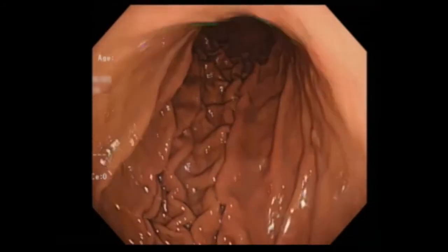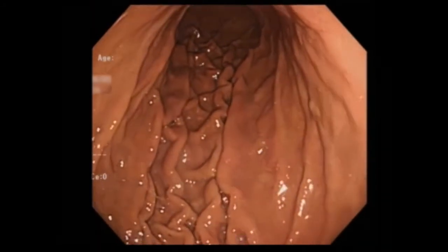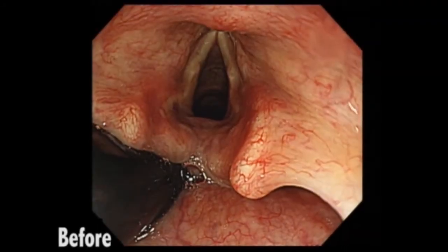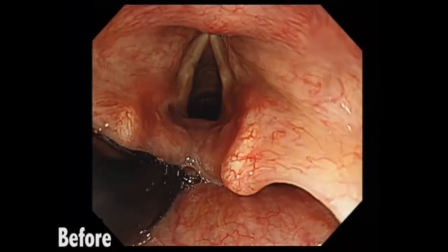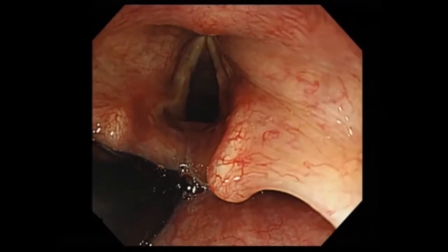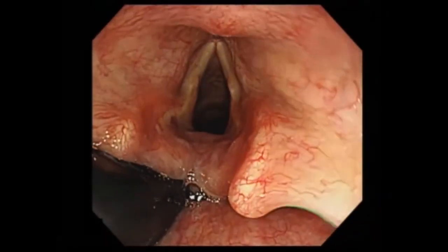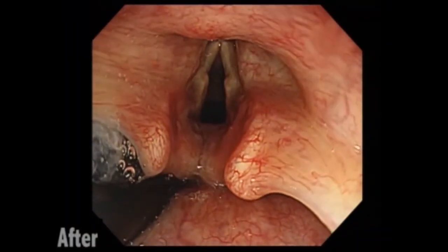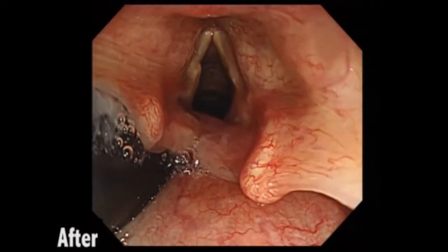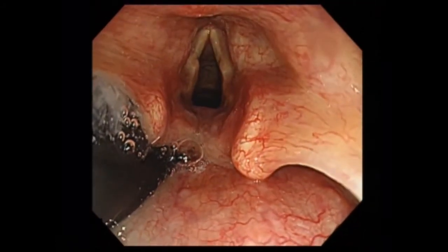As a result, all mucous membranes between the folds could be observed. This is an endoscopic image of the pharynx before cricoid pressure. After applying cricoid pressure, the hypopharynx was closed, while the airway remained open.